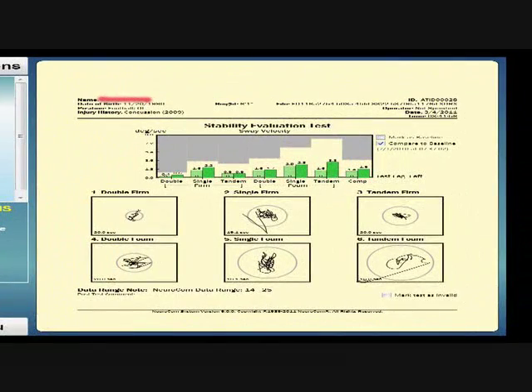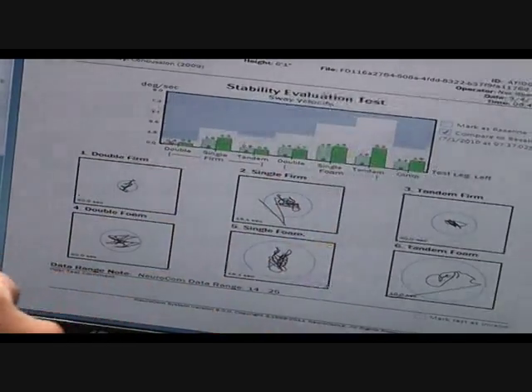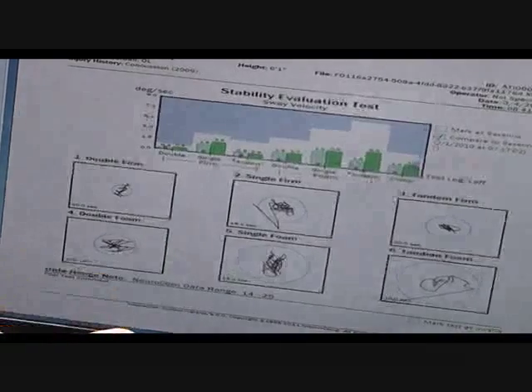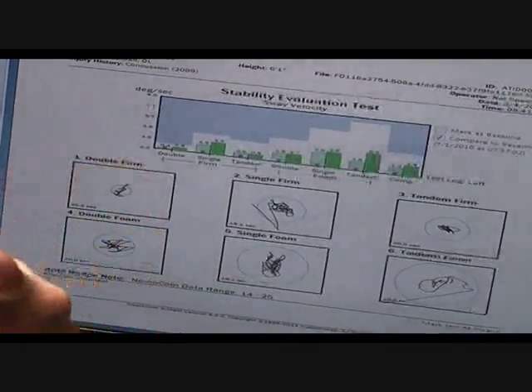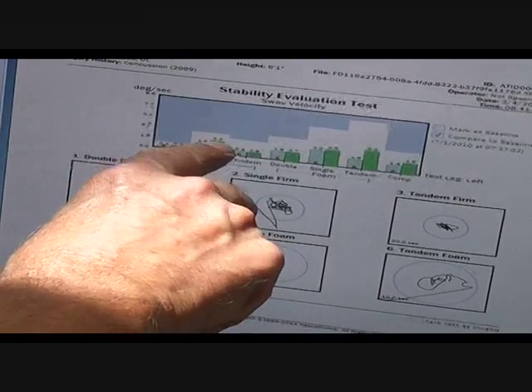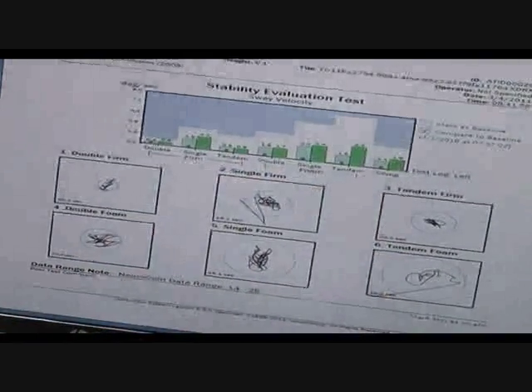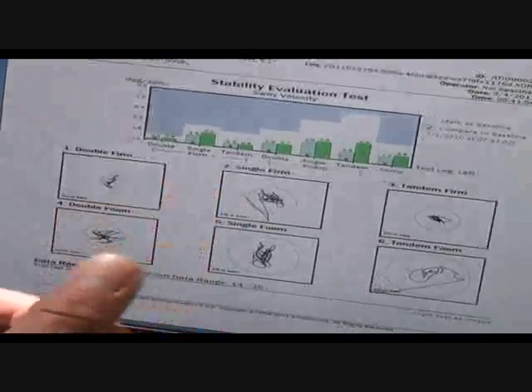We have scores here comparing your baseline — done before the season started — on the left, against the ones on the right, which were done after your suspected head injury. You can see all of the post-injury scores are a little higher. If you had no head injury, the baseline test would be equal to the one after the impact. But here, the second column is higher, indicating that your sway, stability, or movement is worse after this impact.